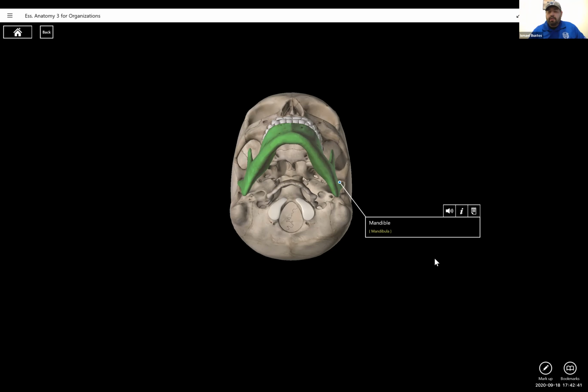Two errors can cause the mandibular condyles to be superimposed over the mastoid. It's either excessive flexion, insufficient extension, or your CR was not perpendicular to the IOML. So those things can cause those mandibular condyles to be superimposed over the mastoids.